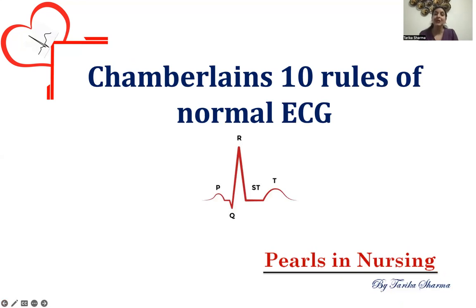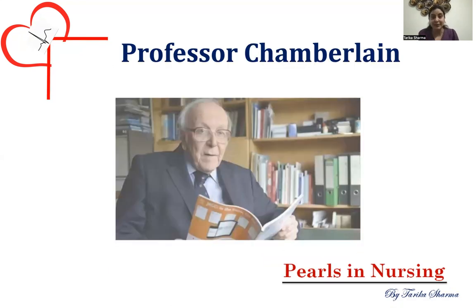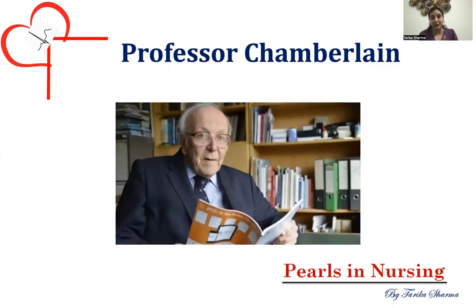Hello everyone. Today we'll be talking about Chamberlain's 10 rules of normal ECG. He is Professor Chamberlain, who is a British cardiologist, and he has done tremendous work in pre-hospital clinical care. He has also given 10 rules for identifying a normal ECG. In this presentation I'll be covering these rules one by one, which will help you to identify the ECG in a better way.